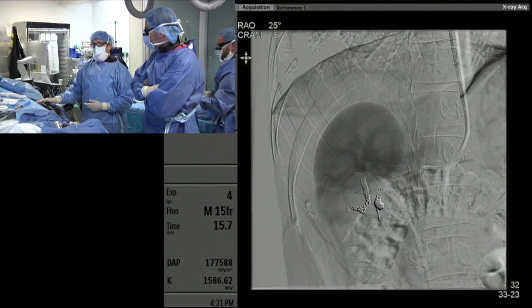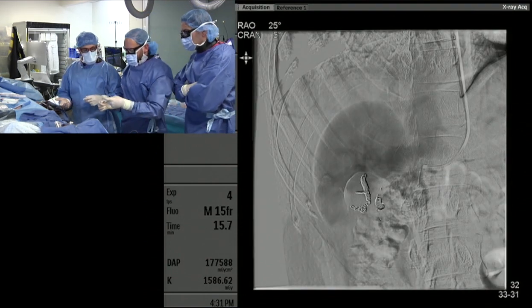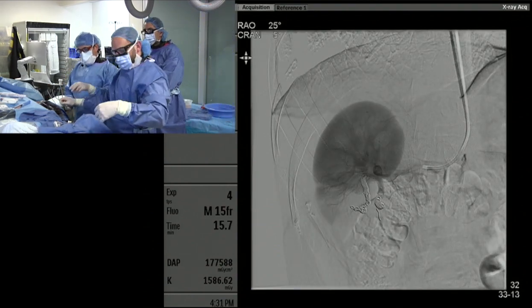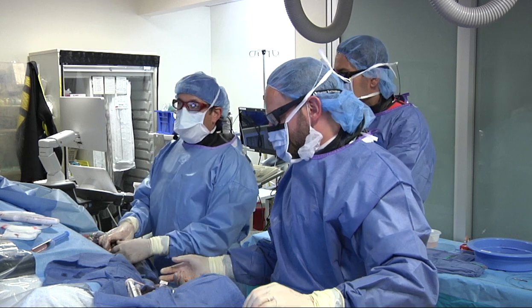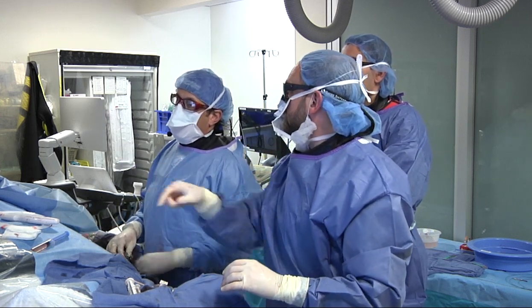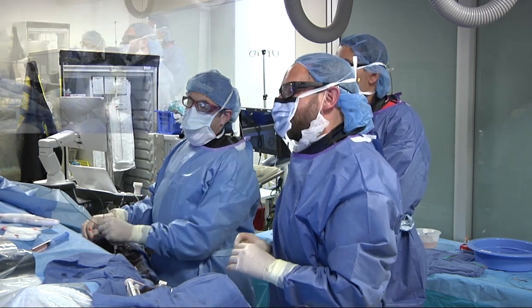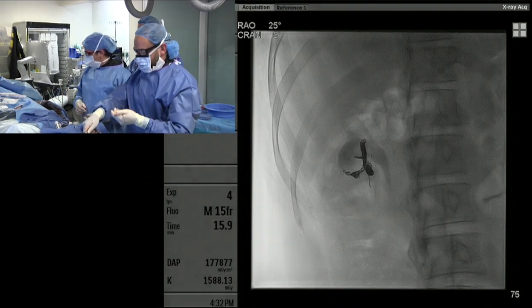Good technique just to keep in mind when you take catheters out from a radial approach, and we talked about stroke quite a bit today, is to take the catheter out over a wire, not take the catheter out without a wire or a microcatheter. And that's what we're going to do here. What I'll do is I'll pull it back into the aorta first. Can we go wide open on the flush as well? Then send the wire down into the aorta, and then take it out like that very quickly without having to flick the catheter up into the vertebral.